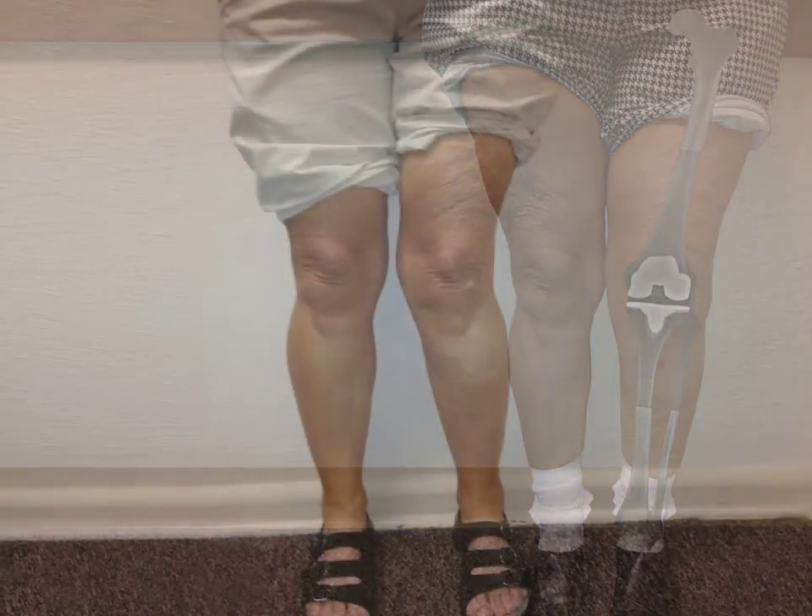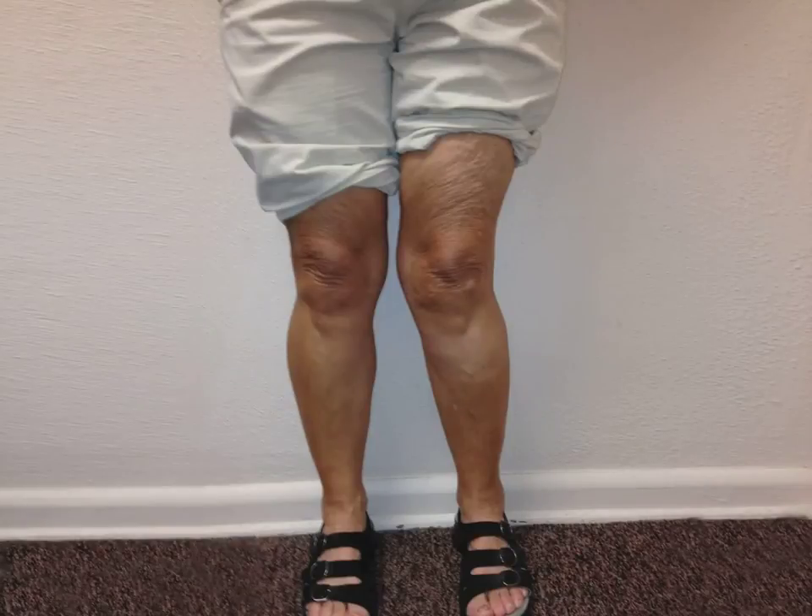Let's see what Mary's knee looked like before surgery. Her left knee has a significant knock knee deformity, and her left hip is even turned inward to try to compensate for her arthritic knee.